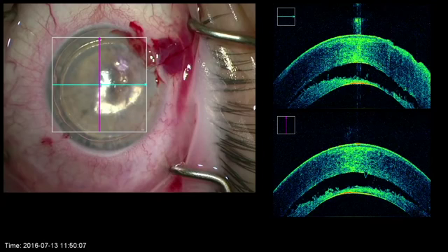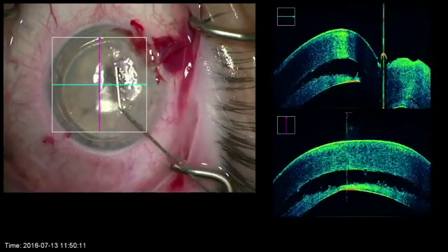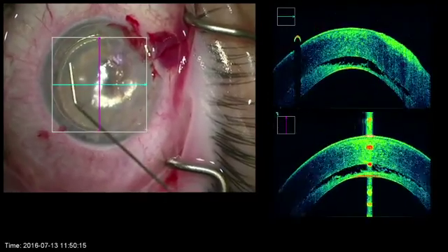However, the intraoperative OCT shows that given this graft is less than 100 microns in thickness, there is at least a 200 micron space remaining between the graft and the host. Now, sweeping over the host cornea with a 30 gauge cannula is performed. Even with only 2 passes, improved apposition of the graft can be seen.